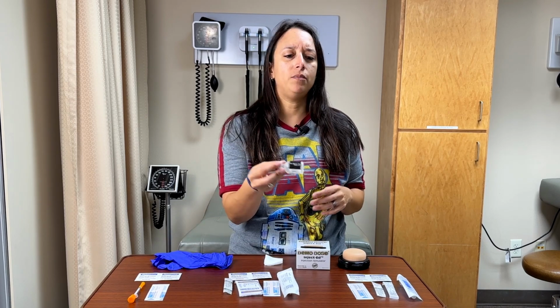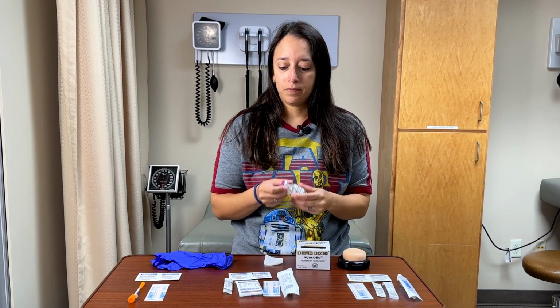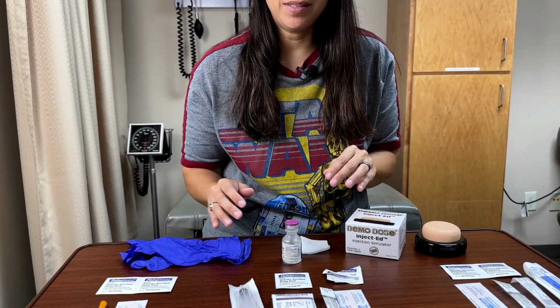After that, we want to take a look at the medication, make sure that there's no cloudiness, that it hasn't been tampered with or compromised, and then we're going to prepare this for the procedure. All right, now I'm going to teach you how to draw up the medication. So we'll go ahead and use these supplies that we have here.